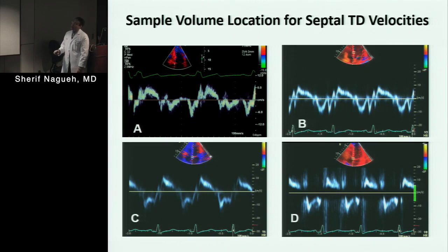So some technical points, not necessarily for the general audience, but more for cardiology fellows. When we look at any signals, we have to scrutinize their quality. It is not just I look at the signal and I accept it. For example, look at the location here. We say we acquire annular velocities at the annulus, septal side, lateral side. See where the signal is, it's way down into the septum. Look at the quality of the gains here, look at the filters here. None of these three signals is a good signal.